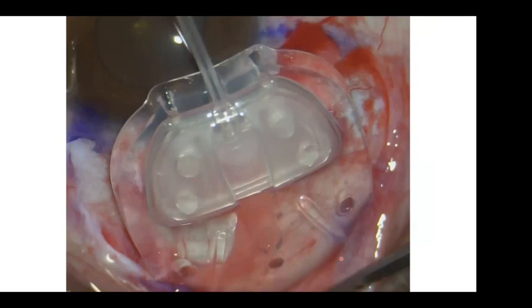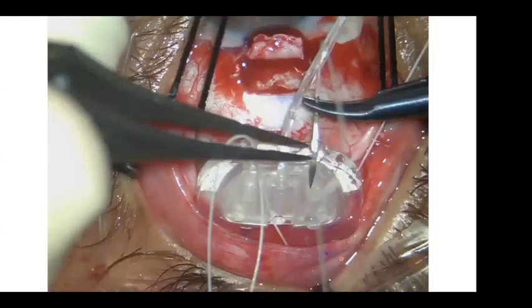One of the tips here is that I use the artery forceps to separate the Tenon's layer. I don't use scissors, because scissors sometimes can damage the tissues. The artery forceps, especially curved ones, have a curve on the sclera, and when I open, it will help the separation of the Tenon's effectively. And the good point is that the implant will go smoothly.